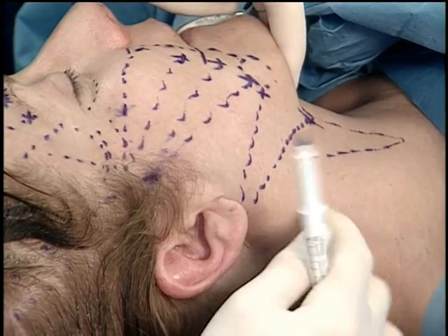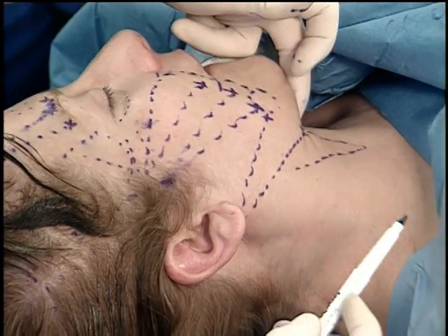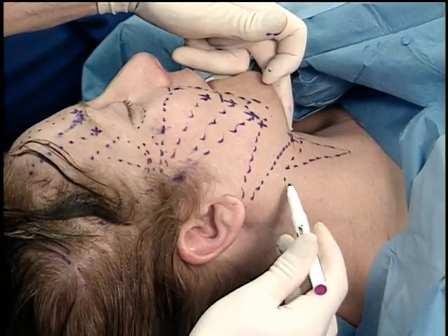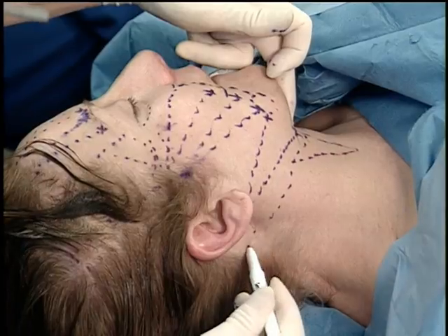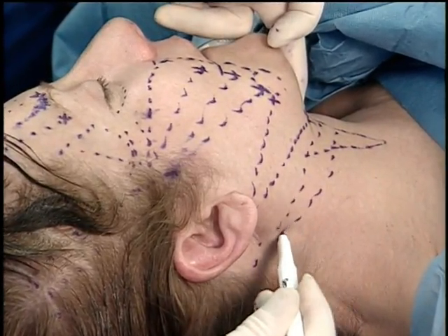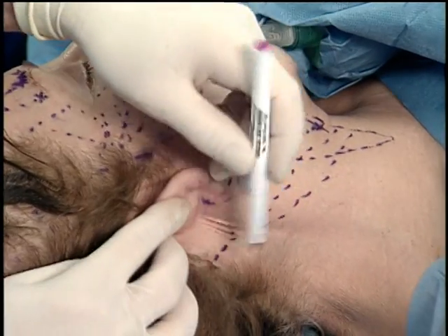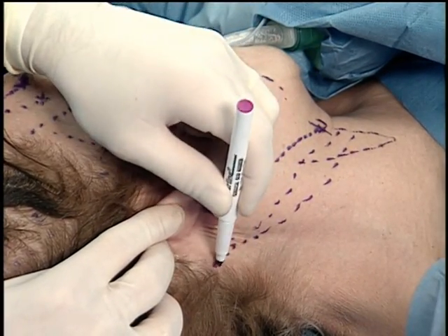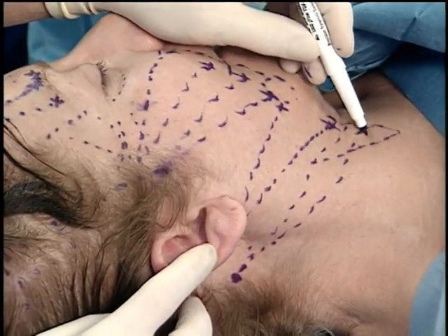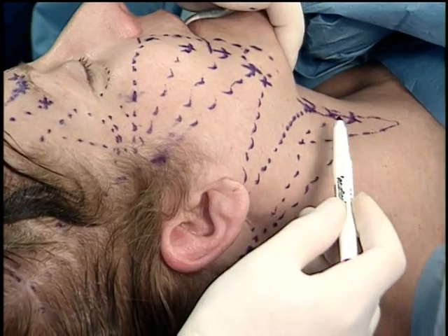Finally, we want to get some tightening on the neck. So I feel for the cervicomental angle here, and that's the level we want to be. We're going to come straight back, a little bit superiorly, to the posterior cervical hairline, with a second one about 2 centimeters below, right up to that posterior cervical hairline. And that will be our common deployment and anchor point. And we want to exit in that lateral tracheal groove, again anteriorly, for all our cervical contour threads.